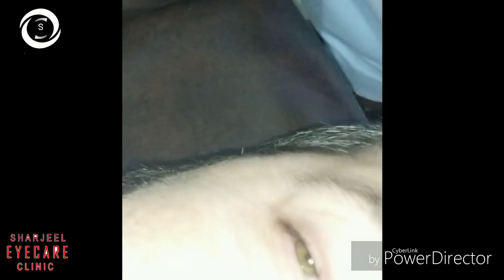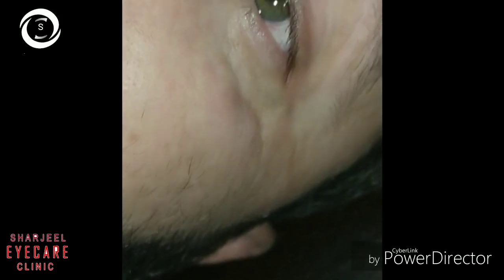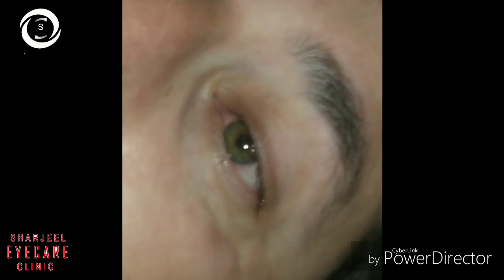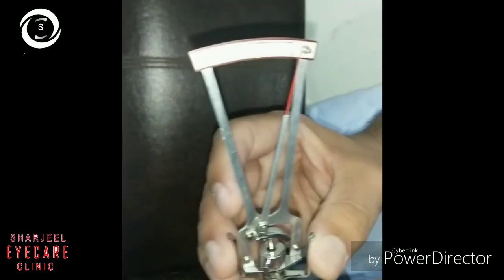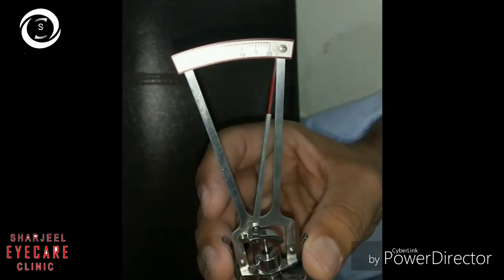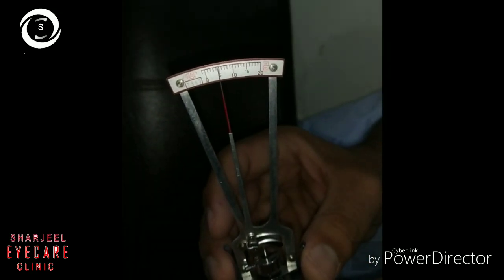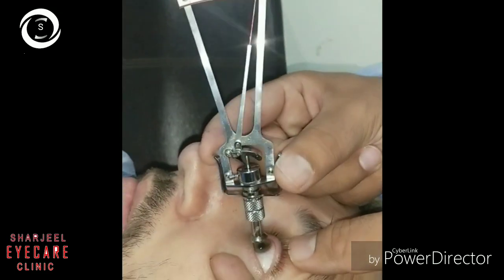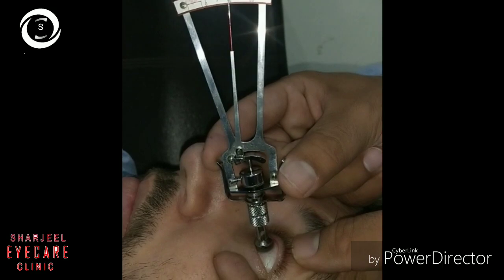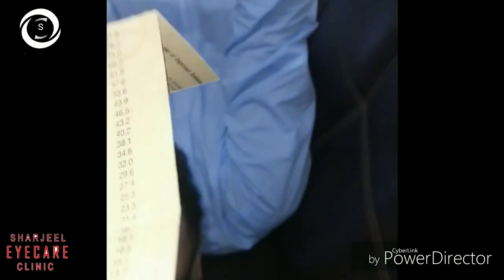Then confirm your readings with the 10-gram weight, because if the intraocular pressure readings coincide with and without weight on the calculation chart, it means you have taken accurate readings. With the 10-gram weight it is five in the right eye and almost eight or nine on the left eye.